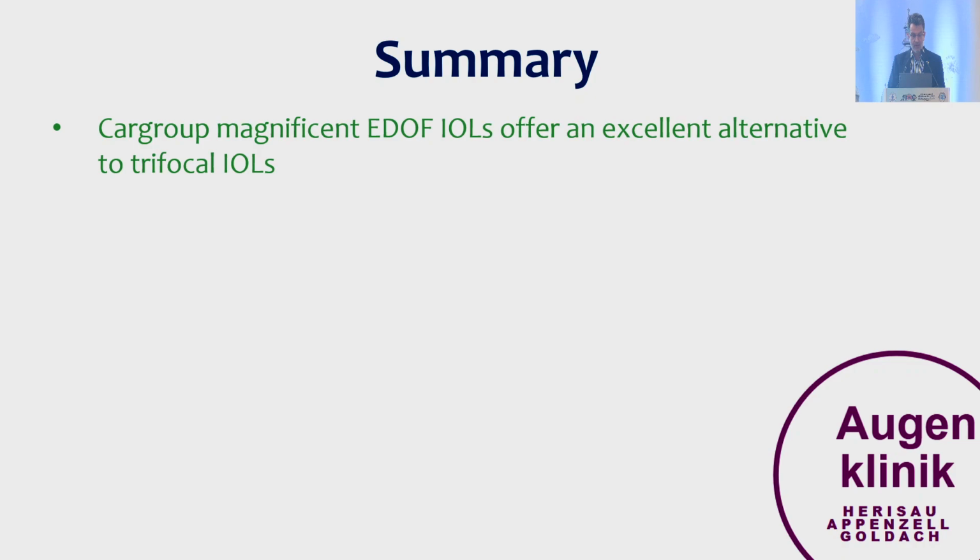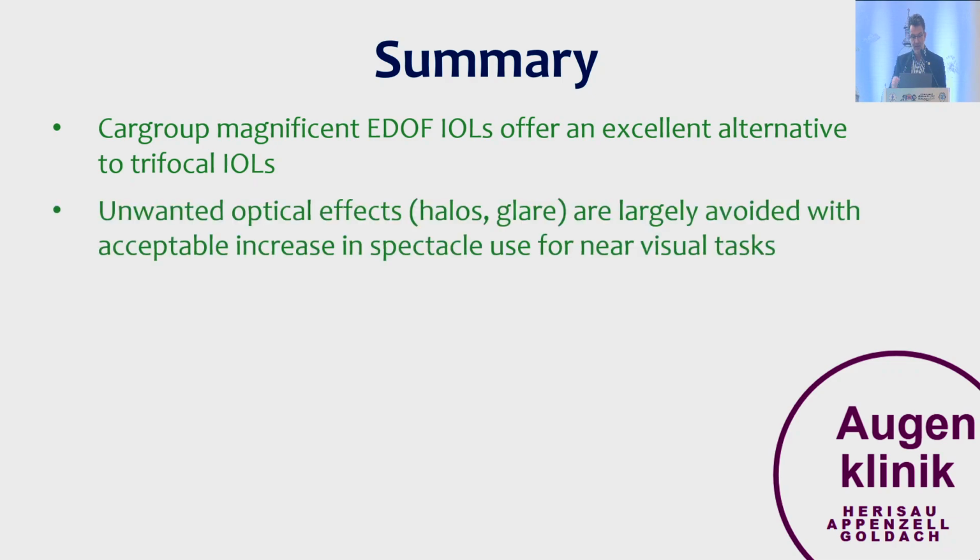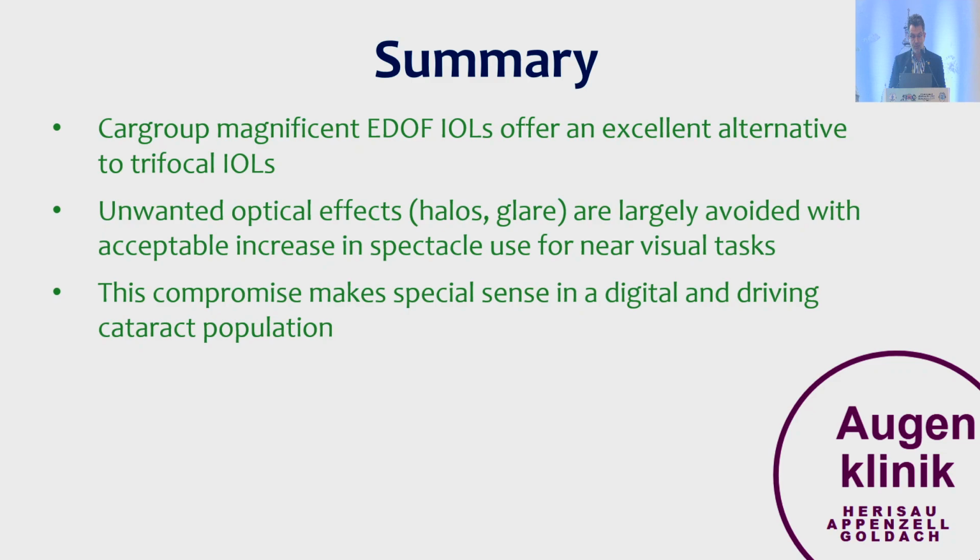So in summary, the EDOF IOLs offer an excellent alternative to trifocal IOLs, and because the unwanted optical effects are largely avoided, this is a good trade-off for an increase in spectacle use for really near visual tasks. And this compromise makes special sense in a digital and driving cataract population, which is definitely also increasing in this country.